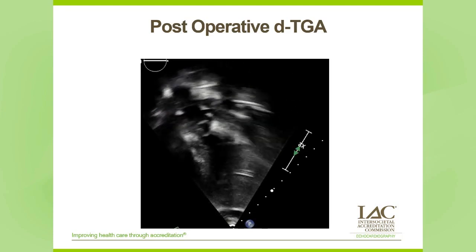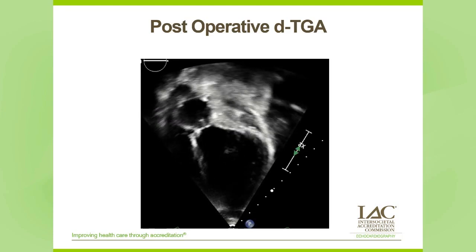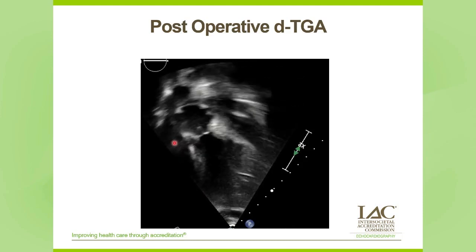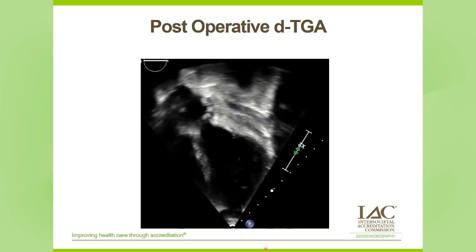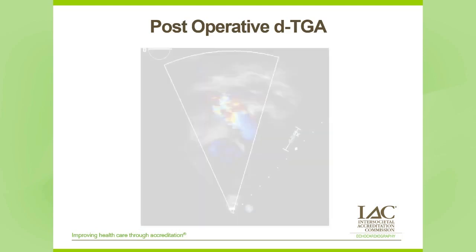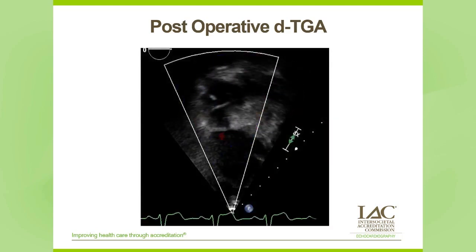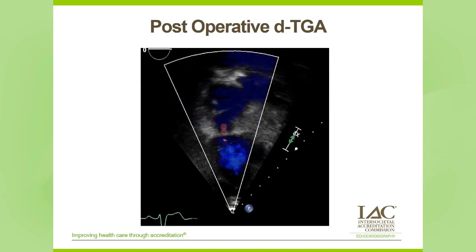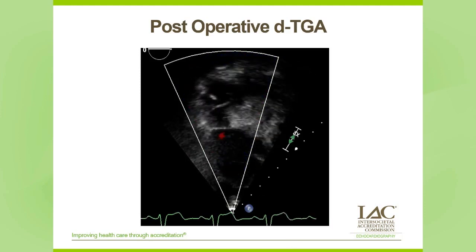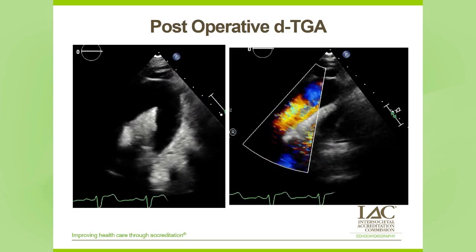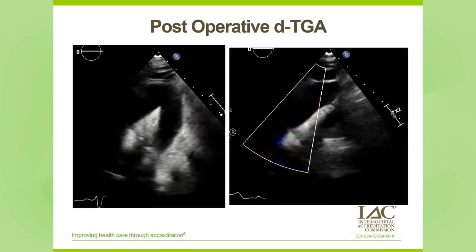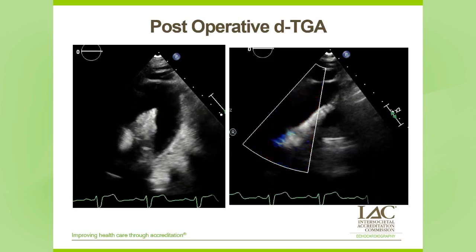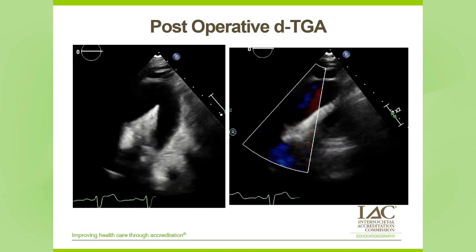In the same patient's apical five-chamber view, you can see the aortic valve and LV, but also the neopulmonary valve and pulmonary artery. With color flow Doppler, here is the LVOT, and right next to it, the RVOT and pulmonary artery. In the suprasternal view, the arch looks a little different from a typical patient, and with color flow Doppler this is a good opportunity to interrogate the supravalvar area or even the aortic valve — demonstrating how non-traditional views are essential for the arterial switch patient.